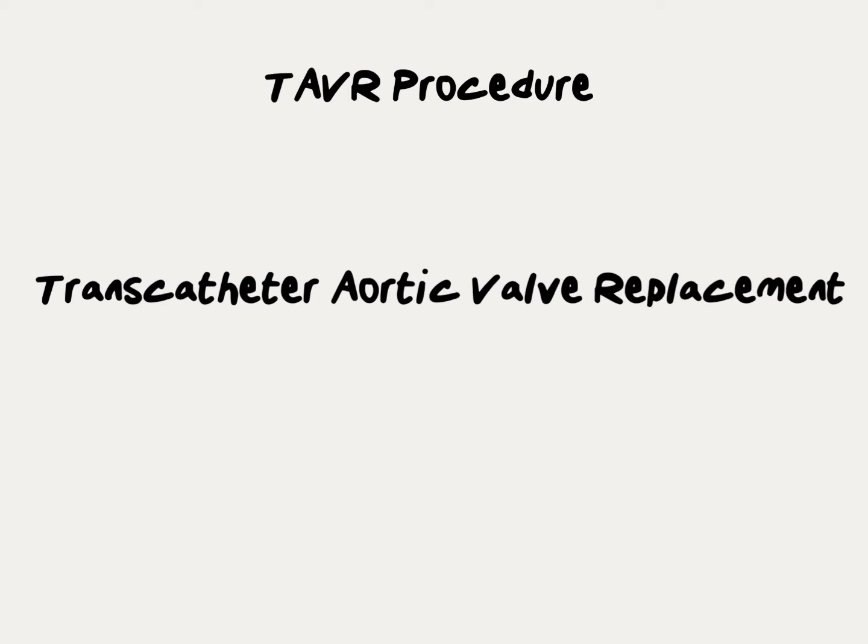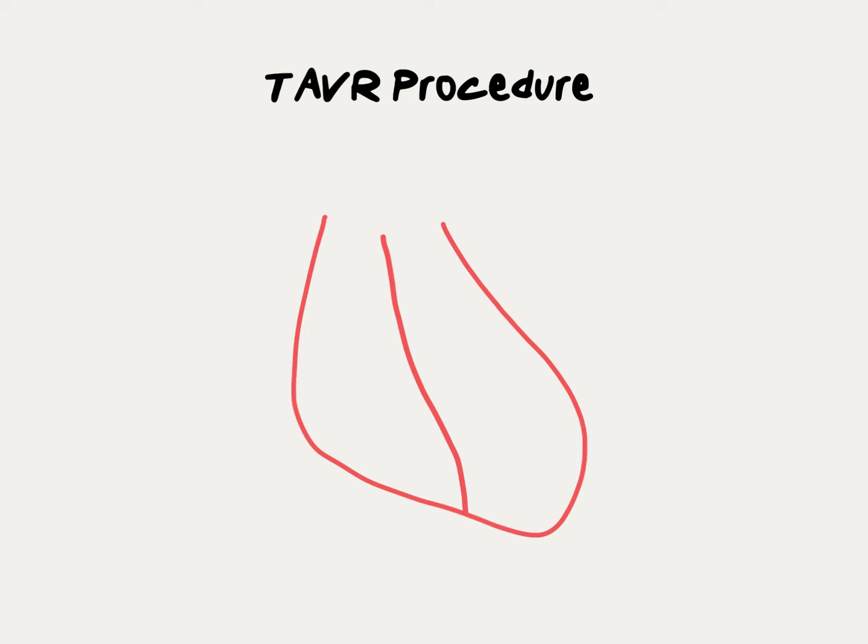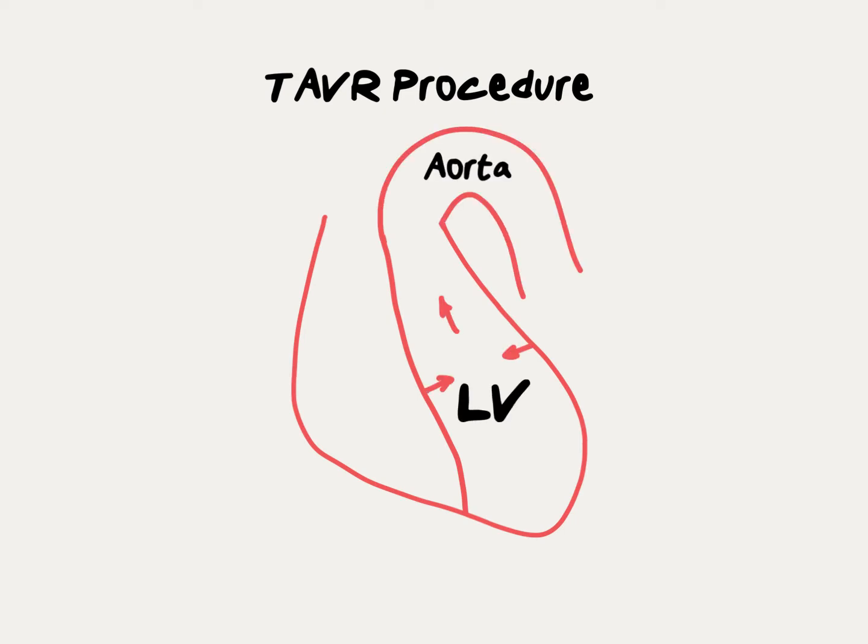This video is a brief overview of TAVR procedure. TAVR stands for transcatheter aortic valve replacement. Within the heart, the left ventricle is responsible for pumping blood through the aorta out to the rest of the body. The aortic valve sits just between the left ventricle and the aorta.